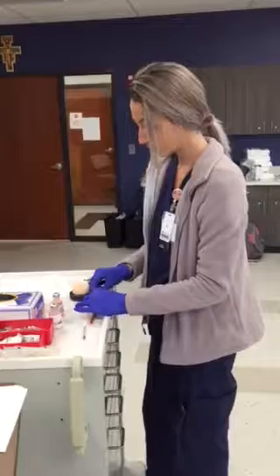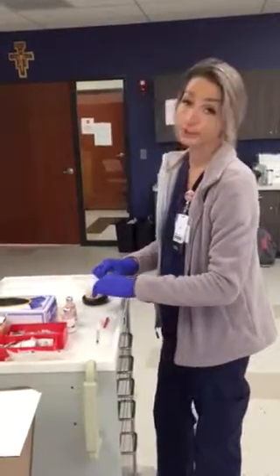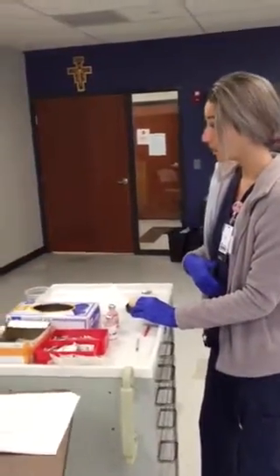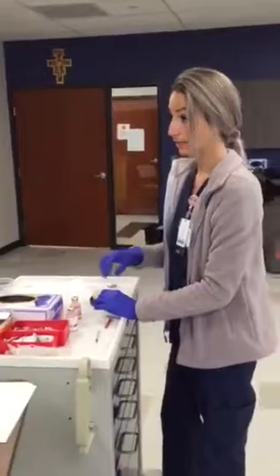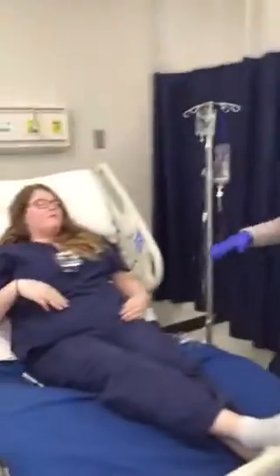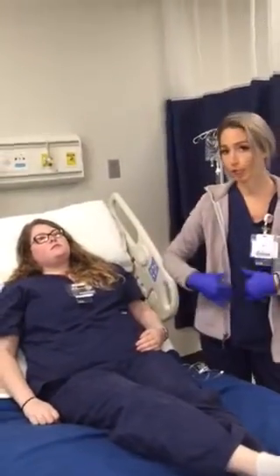So for her heparin here, it's going to be a sub-Q. So again, would you like it in your stomach? Mm-hmm. And then left or right side? Right. Okay, so for her right side, so on her stomach, I'm going to go about 2 inches over from her belly button.